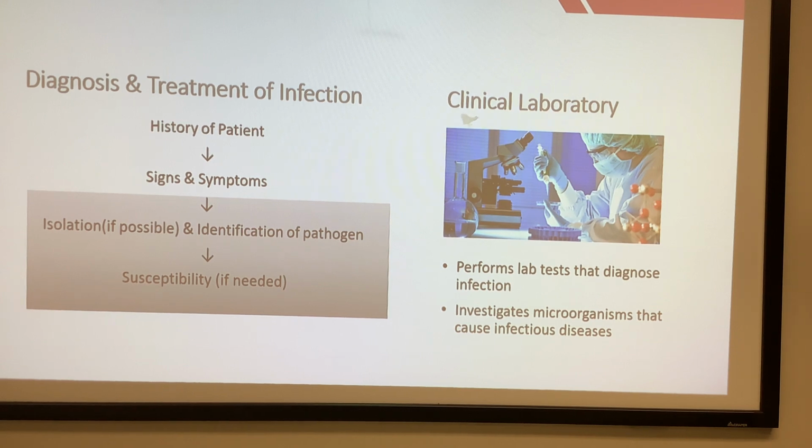And the patient themselves present the history, and they also show their symptoms, right? These are collected by the patient care team, and they share the information with us as clinical laboratory. And what we do here is the highlighted part, but also the hidden part from you guys, from the physician, from the patient as well, which is the isolation and identification of the pathogen.